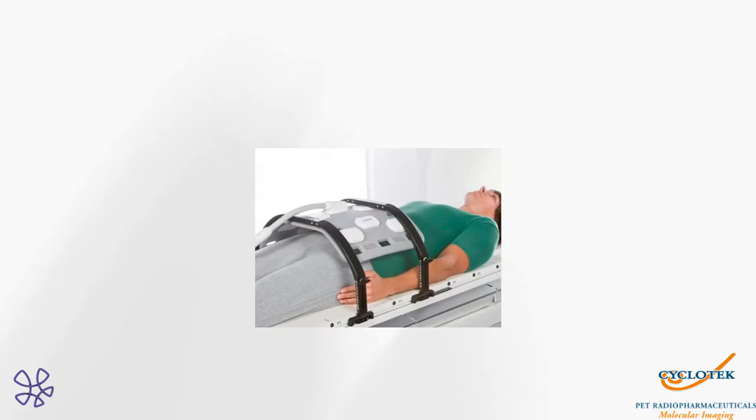So it's not always the same. If he's close to heavy metals, he responds differently to if he's on his own. And that's important because we give contrast. So a magnetic or paramagnetic material called gadolinium, we give that to alter his environment. He gives a different signal when he's in that environment. And this is how we do it.